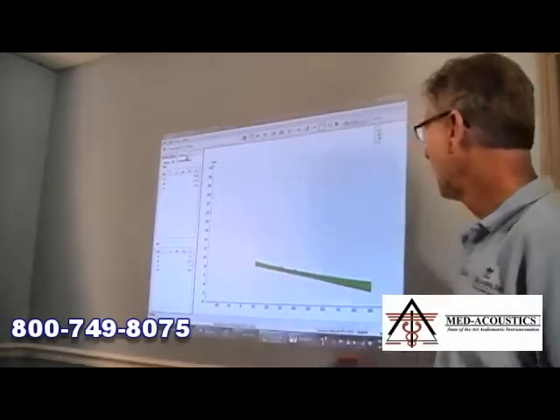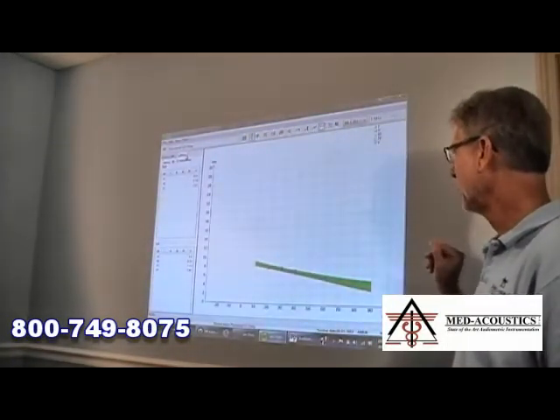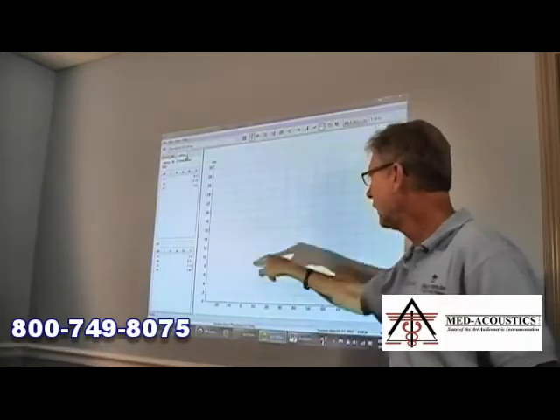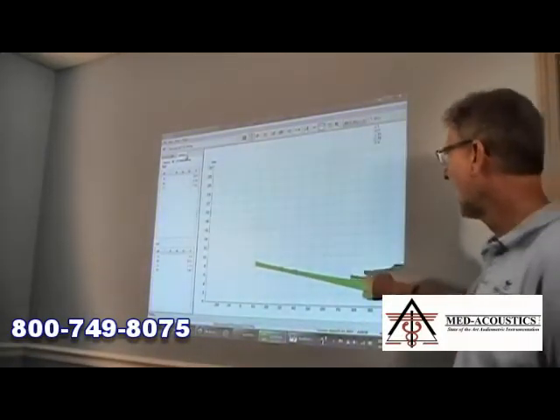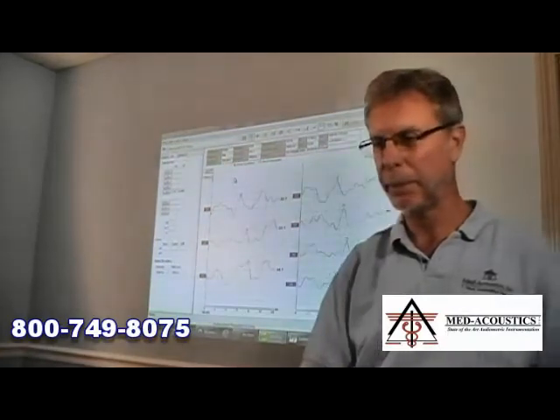And of course, there are norms in it. Here we have the normal area for wave 5 for the age of the patient that we just did, and you can see that the 60 dB, 40 dB, 30 dB, and 20 dB responses that we marked are plotted on this latency intensity graph, and they happen to fall. This is my wife's Jan's ABR, and they happen to fall within the normal range, so she's good. Okay. So there are norms incorporated in here. You don't have to put them in; they're already in there. Where do we get them? Mike Gorga's research at Boys Town.